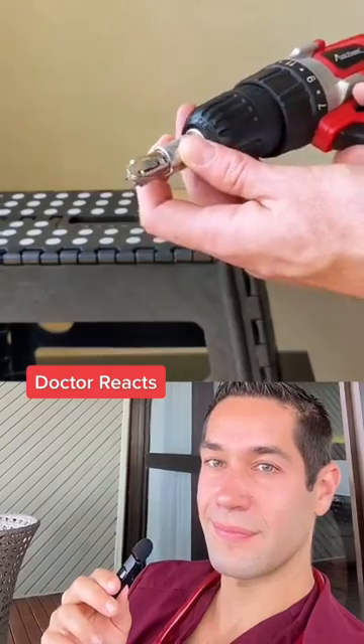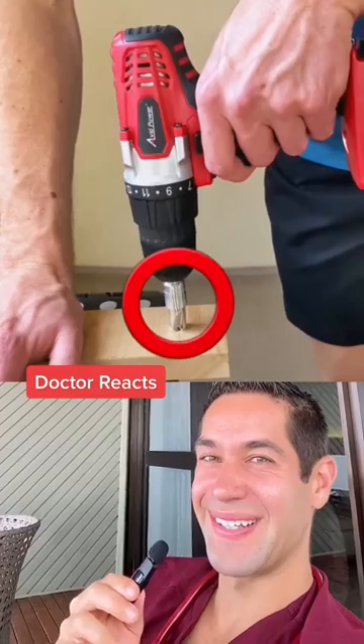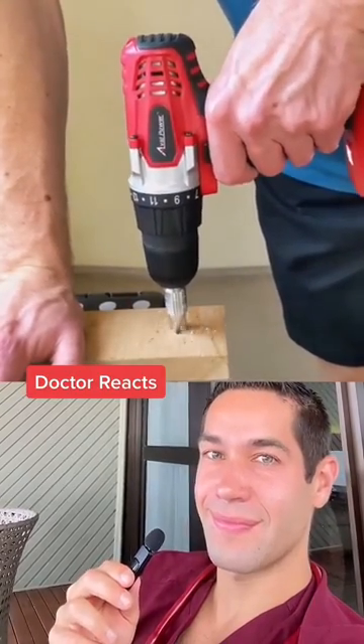Let's watch the same mechanism again in real time on my genuine piece of skull bone here. Watch how that top portion is spinning freely because I don't have enough pressure applied, and then as soon as I apply enough pressure, the drill bit engages and I can drill.